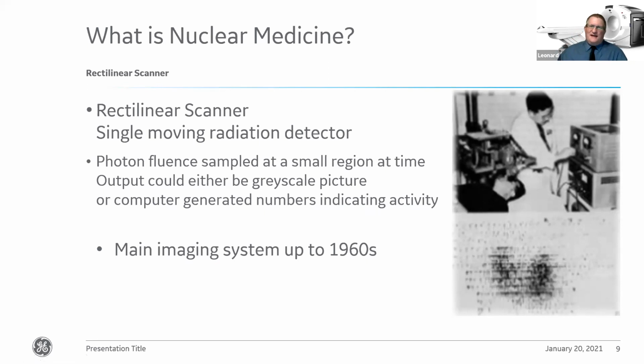The main thing as it's coming across is this is actually one of the first things that was imaged with a rectilinear scanner, and it was predominantly what they were looking up, even towards the end of its use. It was the main imaging system even into the 1960s, and I must admit, I'm not that young anymore, but I was actually using a rectilinear scanner when I first started my jobs and was training as a radiographer.